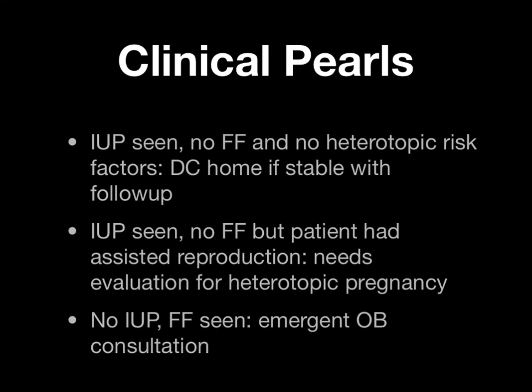What if you have a patient who has no intrauterine pregnancy, no free fluid seen, and a quant less than 1,000? Remember, since all we've done with this study is look at intrauterine and cul-de-sac findings, we have not addressed the adnexa, so these people need comprehensive scans since their differential includes early IUP, occult ectopic, or pregnancy failure.